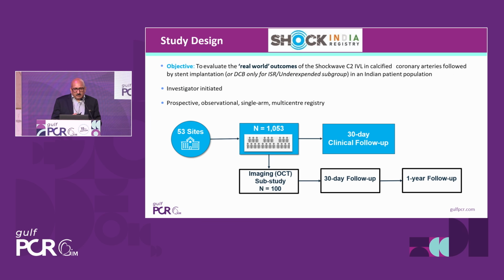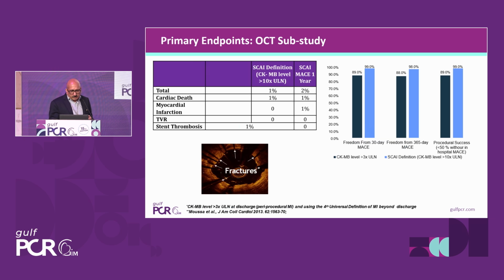This is a quick run-through of the Shock India Registry, which was presented many times in various other meetings. It was a study with an OCT sub-study of 100 patients.